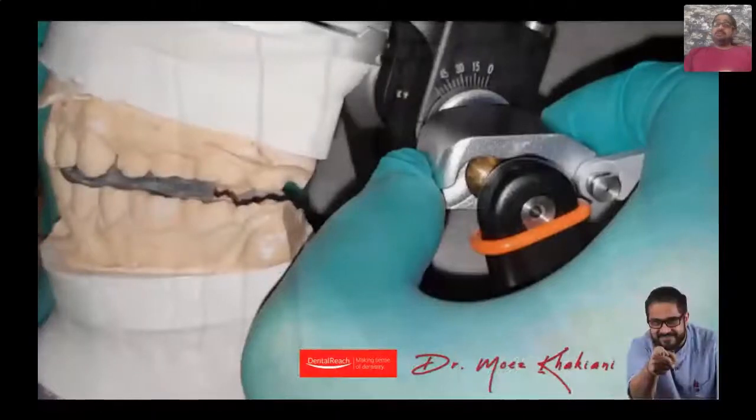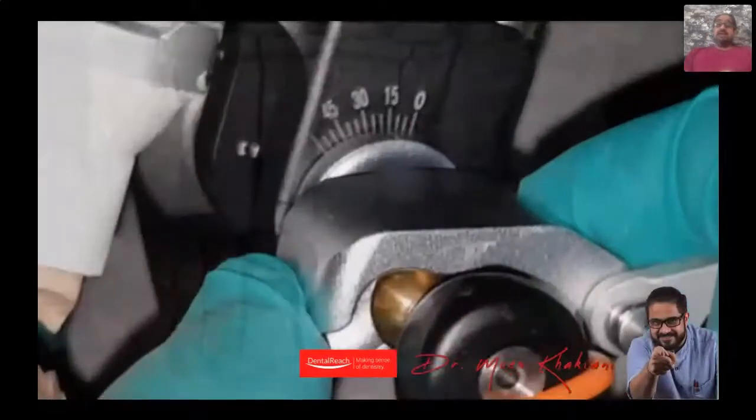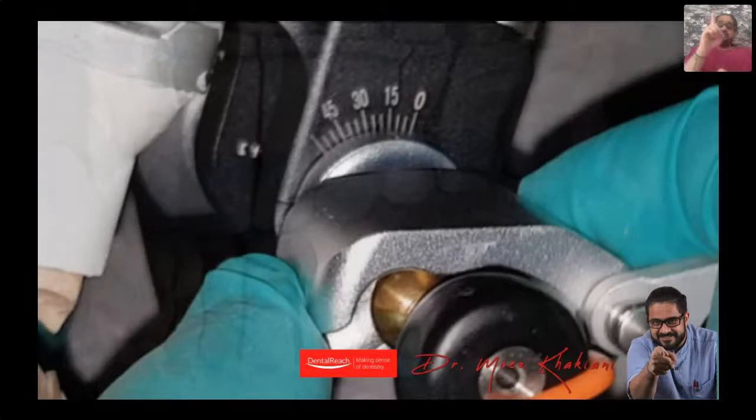Because friends, a semi-adjustable articulator, as you can see at the back, has numerical values written there, 0 going up to 60. Each stroke is about a 5-degree change in the angle, which means I can customize the horizontal condylar guidance of the patient on the semi-adjustable articulator. H value is frequently termed as the posterior determinant of occlusion.